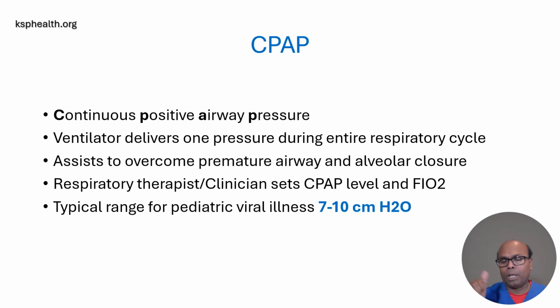This RAM cannula can provide CPAP, it can provide BiPAP, and you can also do pressure control ventilation through the RAM cannula. That is an advantage of the RAM cannula over other kinds of conduits.